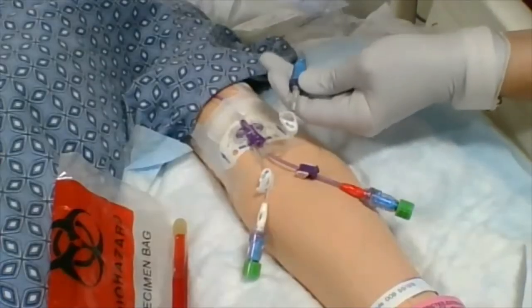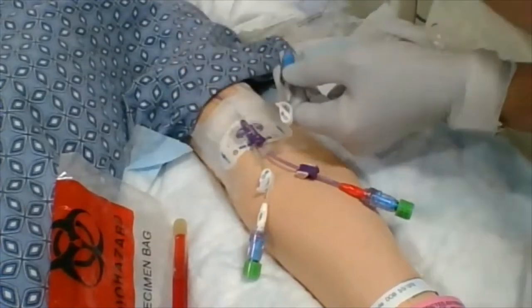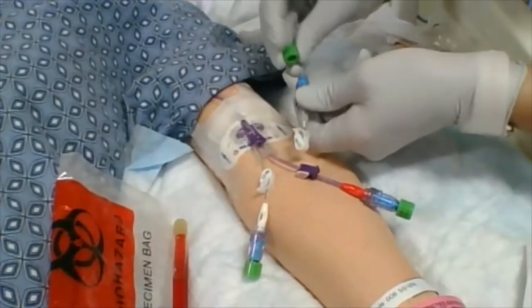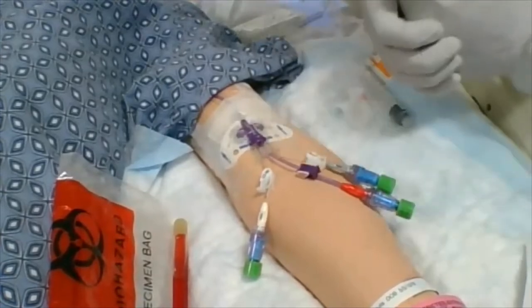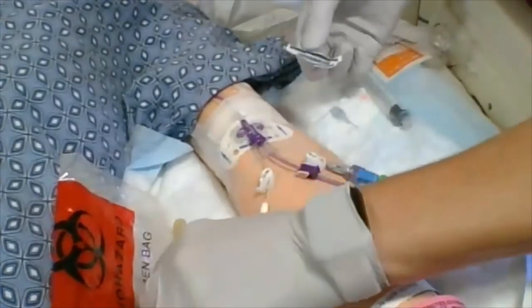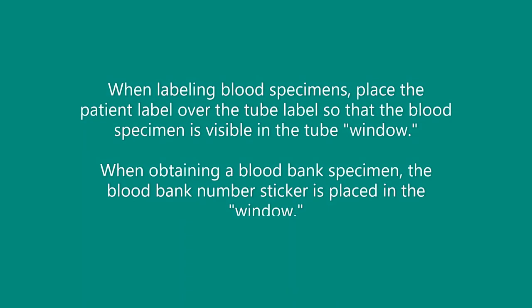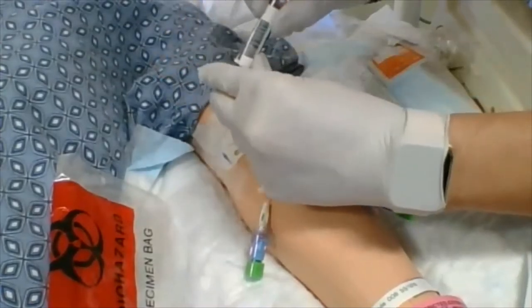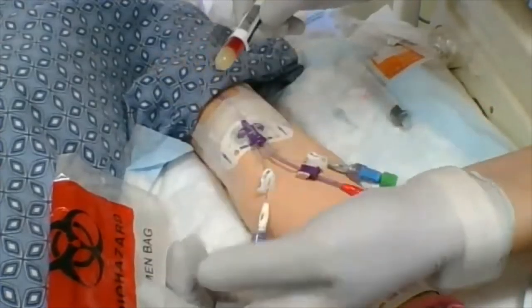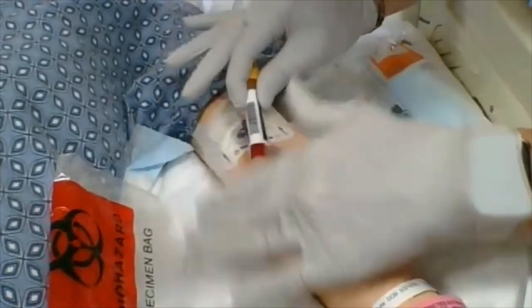I'm going to take off the syringe and dispose of it. Clamp here, clamp here. Get a brand new Kuros cap off my line on the IV pole, screw it on — perfect. It's as simple as that. I'm going to take my label for the specimen and apply it to the tube, using my patient's ID as well. Date and time should all be on here. I'm going to do this at the bedside so we don't mix up blood — this is best practice.